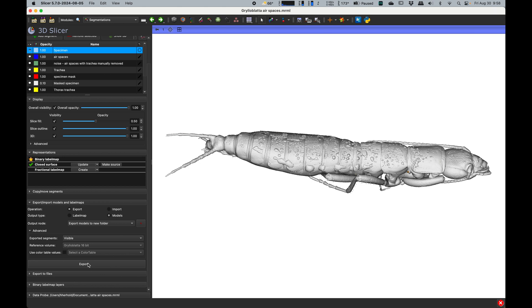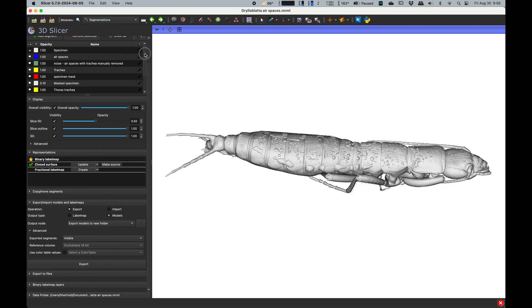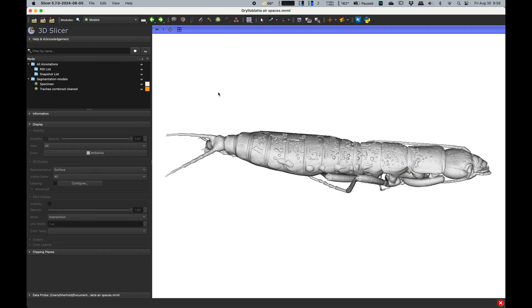Then you can go to the models. Right now it's actually showing 3D views of the segments in segment editor and the models. So what we can do is we can turn off the segments here, turn off that one, turn off that one. Right now it's only showing the model.